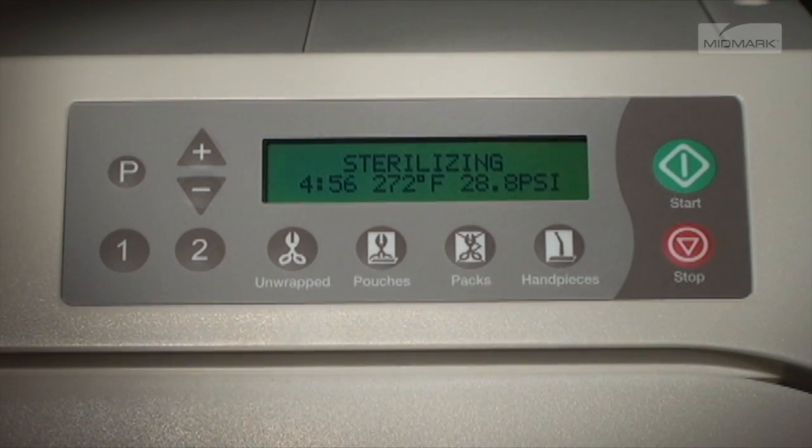Once the appropriate sterilizing temperature is reached, the display shows the time countdown from the program time and monitors the temperature and pressure. During sterilization mode, the heater will cycle on and off.